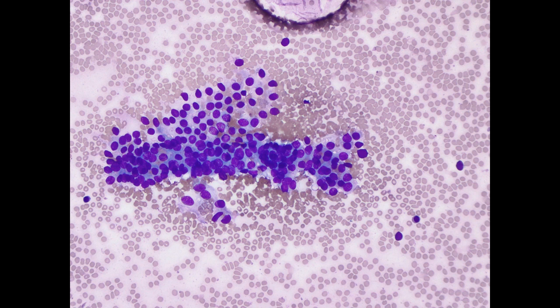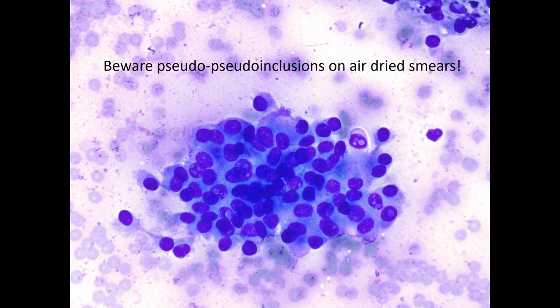On higher power, the nuclei are enlarged and somewhat elongated, and a vaguely papillary arrangement can still be appreciated, though true fibrovascular cores are not always evident. Watch out for pseudo-pseudo-inclusions on air-dried smears — red blood cells can sometimes get stuck on top of nuclei and create pseudo-pseudo-inclusions, although this one looks pretty real.